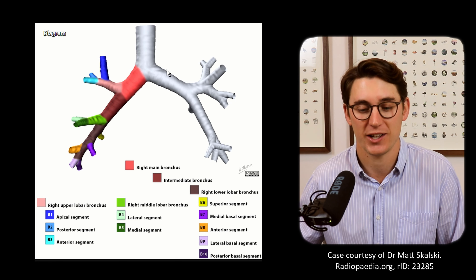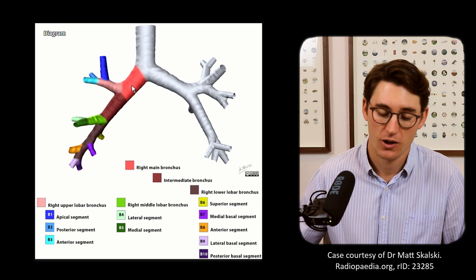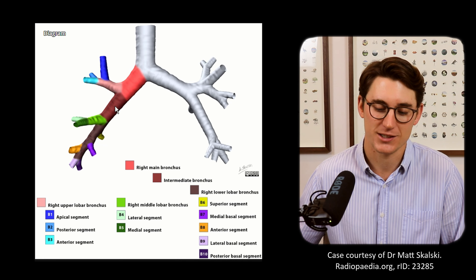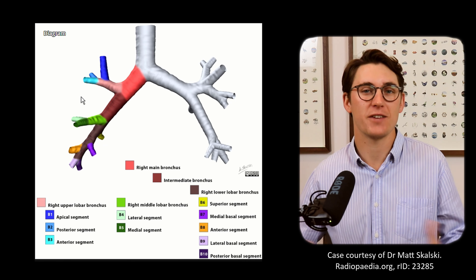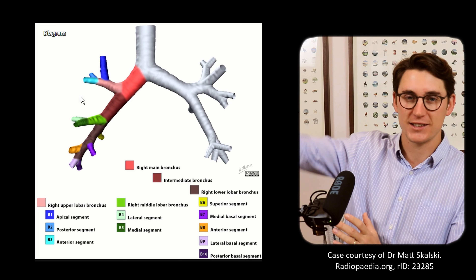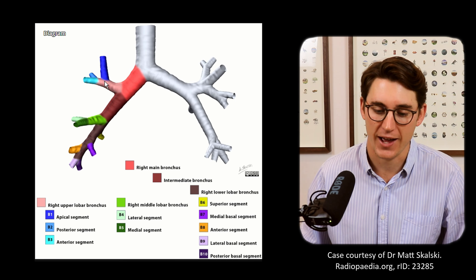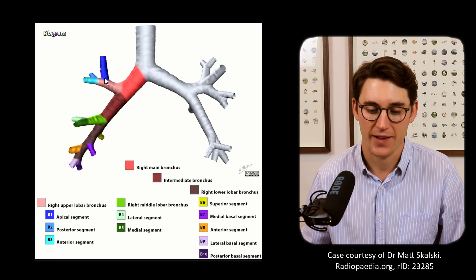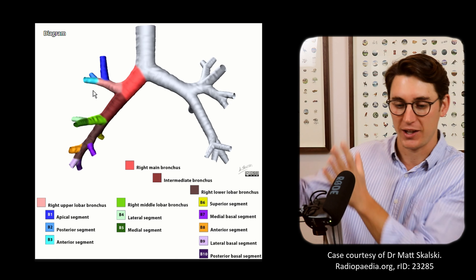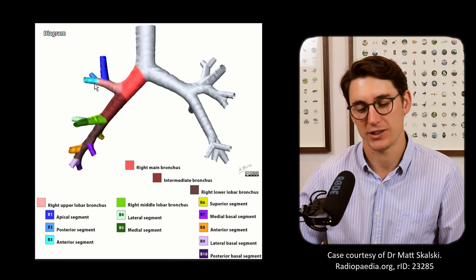We can see the trachea coming down centrally, bifurcating into our right main bronchus and our left main bronchus. On the right side, the right main bronchus goes into our right upper lobe bronchus and our bronchus intermedius. The right upper lobe bronchus gives off three branches — best thought of spatially as a triangle: one arm going upward to the apical segment, and two going out laterally as the anterior and posterior segments.